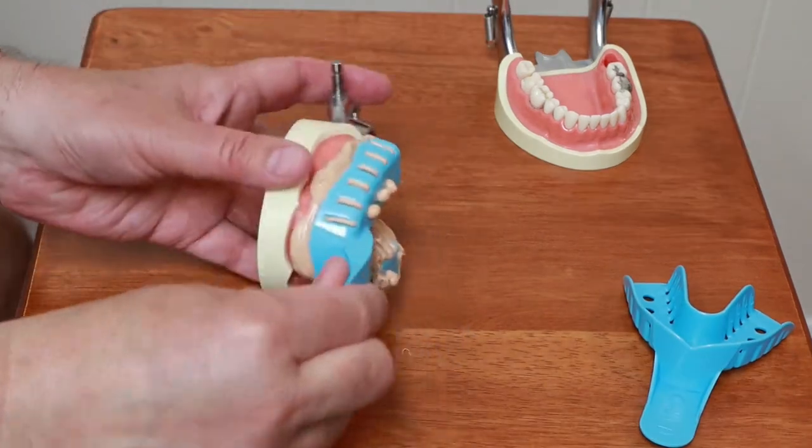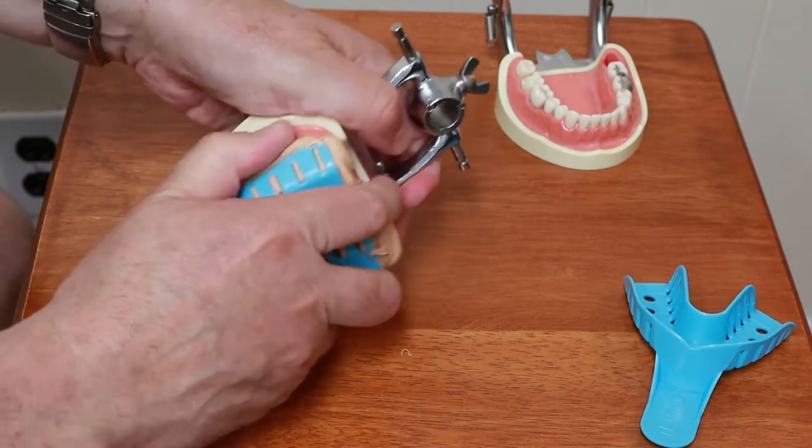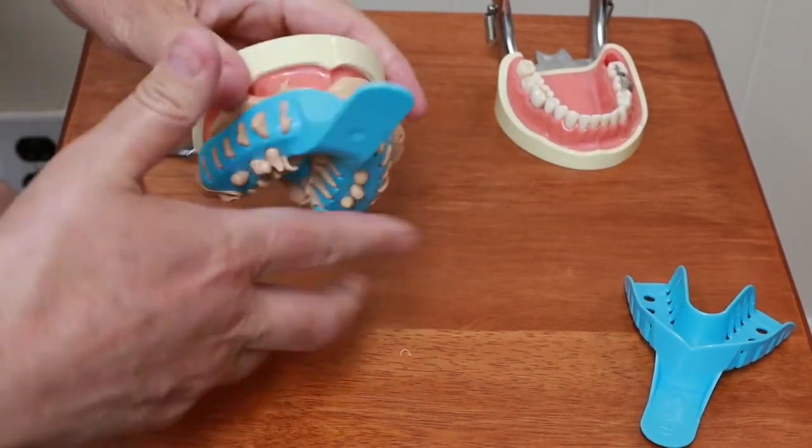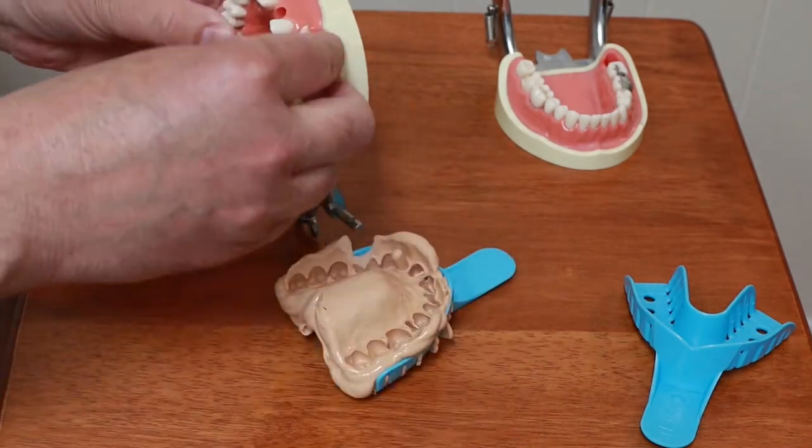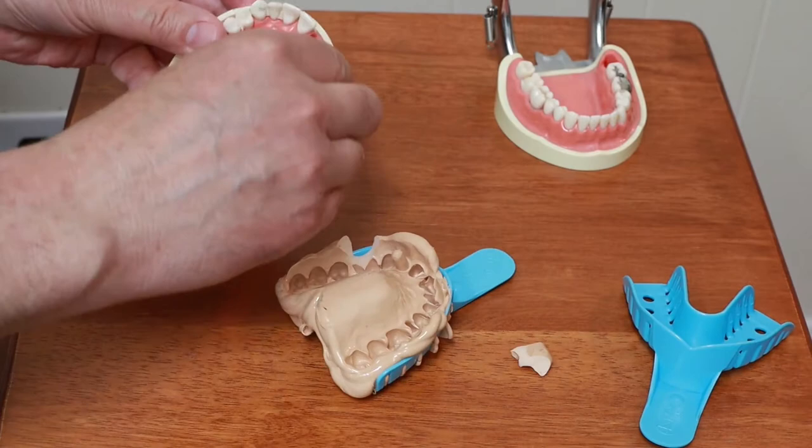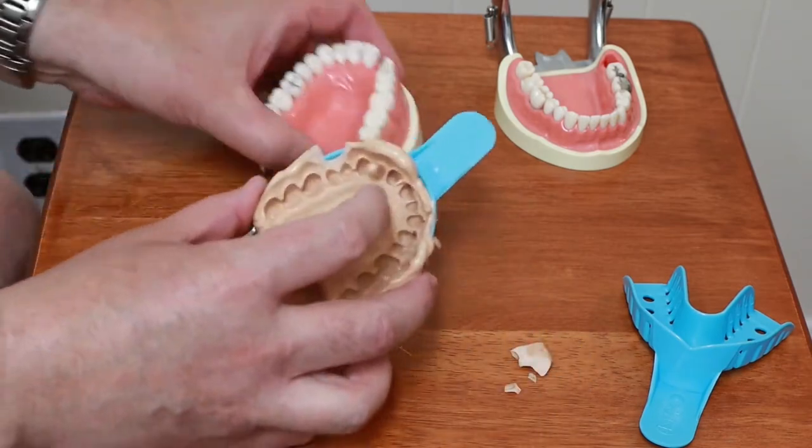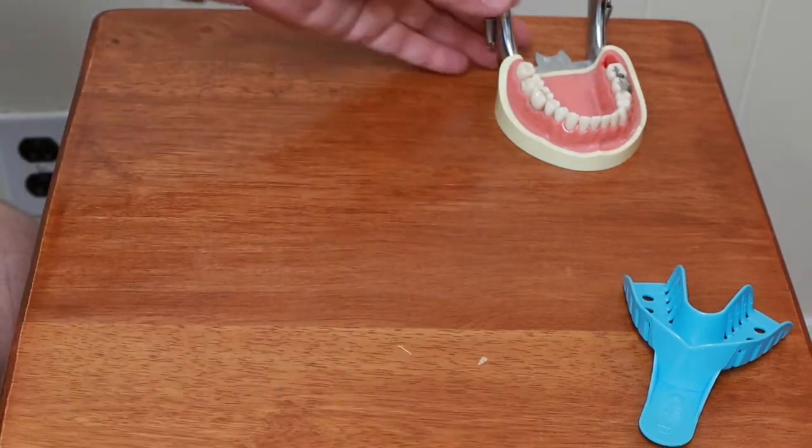Material's set up. Let's just separate the mold. There we go. And there you can see where the hole was and this will go off to the lab. Next we'll take a mold of the lower jaw.